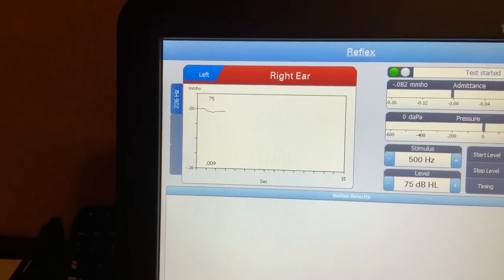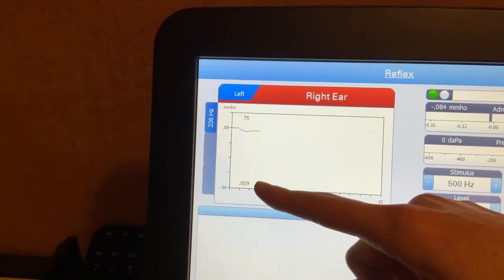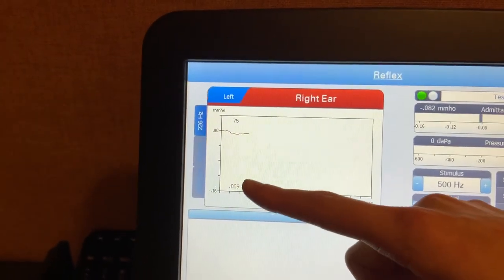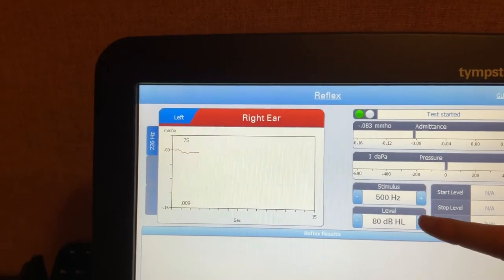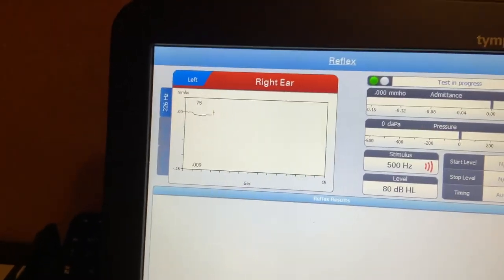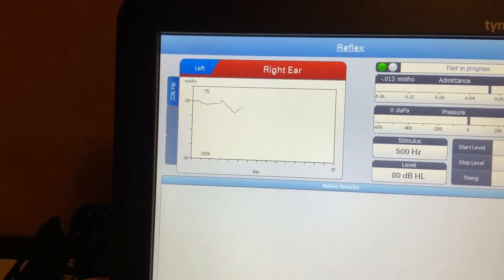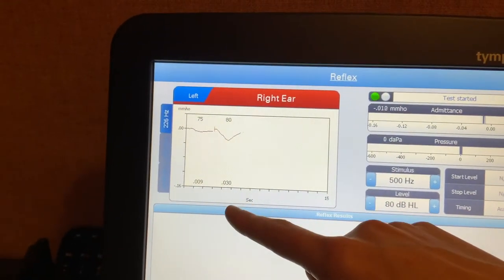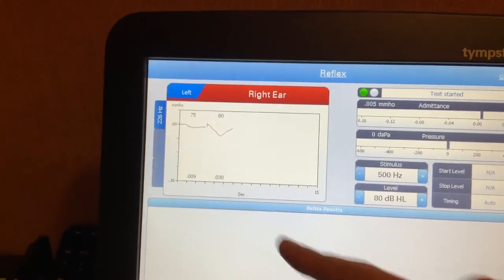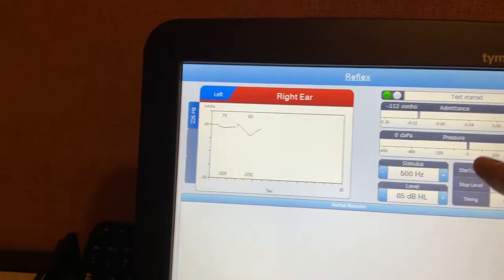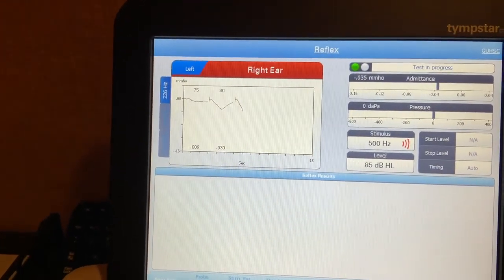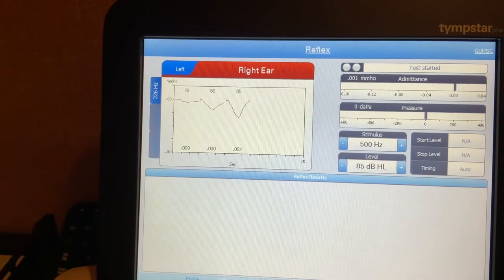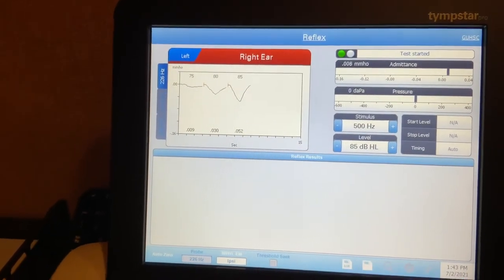And as you can see at 75 dB HL, Sarah does not have a response. We are looking for a response of 0.02. So now we're going to go up 5 dB to 80 and present again. And Sarah does have a response here with 0.03. But what we want to be seeing is a growth pattern. So we're going to test one more time at 85. And there we have it. So Sarah's response is at 80, ipsilaterally at 500 Hertz.